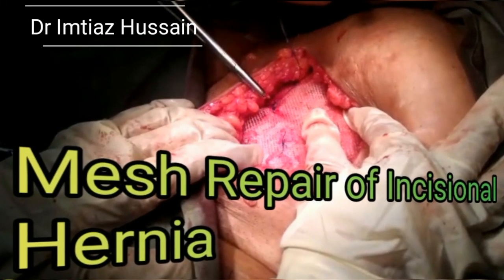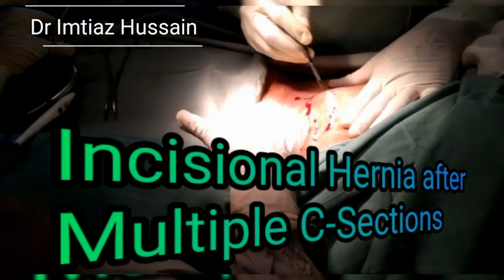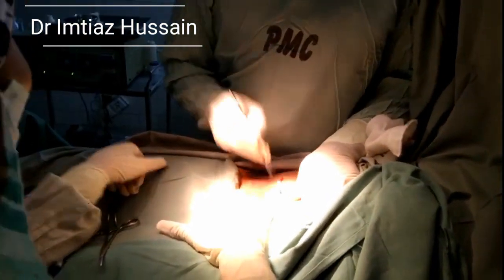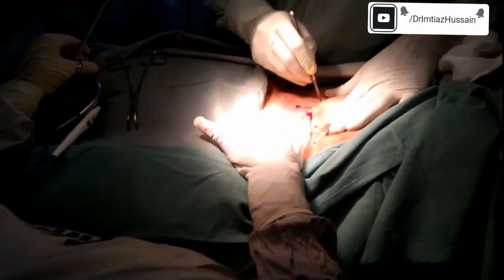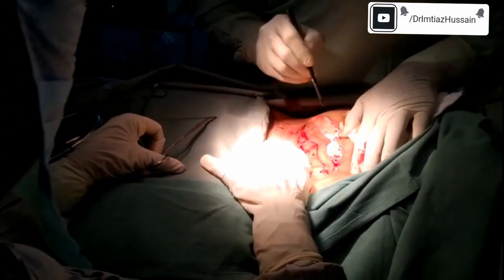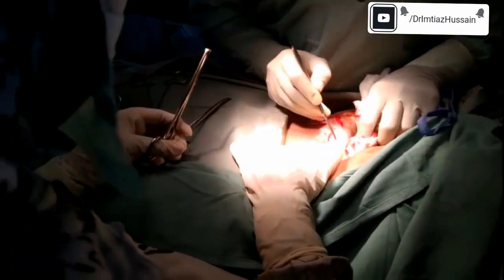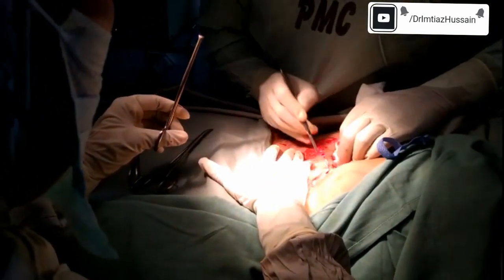Today we will show you the procedure of mesh repair for incisional hernia. This incisional hernia occurred after multiple C-sections. After painting and draping, we will give an elliptical incision in order to remove all the scar tissue and extra stretched tissue due to the hernia sac. After the incision, we will remove the elliptical scar and deepen the dissection up to the level of the sac.